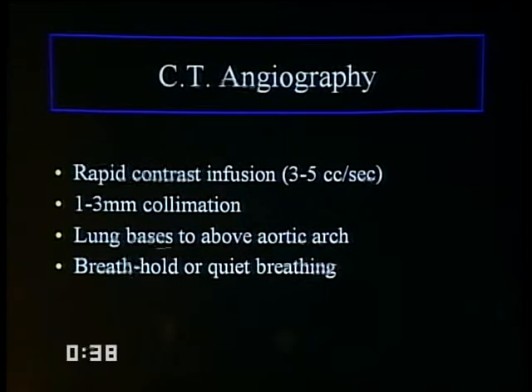Most scan from the lung bases upwards, because if the patient holds their breath for only part of the scan, the lung bases will be captured during the breath hold, and that's where the motion is. Breath hold or quiet breathing, I think that failure to hold breath is worse than just breathing very slowly and quietly, and it's certainly worth working with your technologist to achieve the very best technique for breath holding. Using hyperventilation, if the technologist understands how to do it, I think can be very helpful too, because it decreases the drive to breathe during the scan.